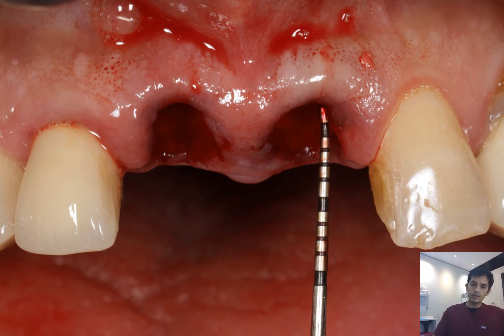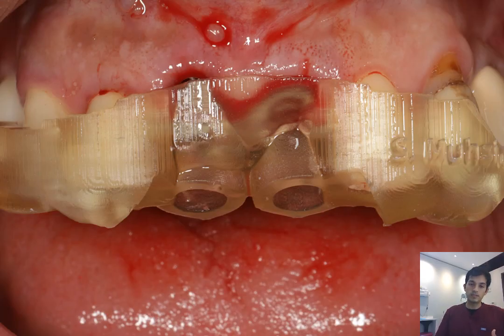Now, I know that there are other lectures coming up where some great clinicians are going to focus purely on immediate implantology. These 2 implants were done in an immediate manner because the situation allowed for it. And I hope we don't have too much overlap of information between all of the speakers. So having verified the integrity of the extraction sockets, that they will still allow for an immediate placement, we now insert our guide into our patient's mouth. This has been sterile packed up until now. This is now when we open it up, when we know that we're proceeding with our implant placement.